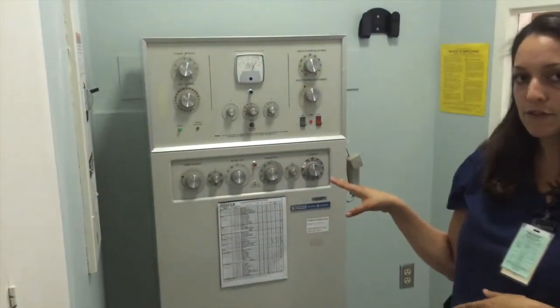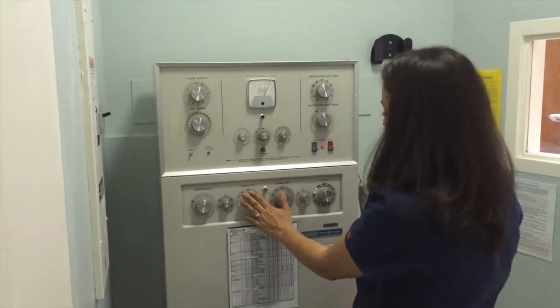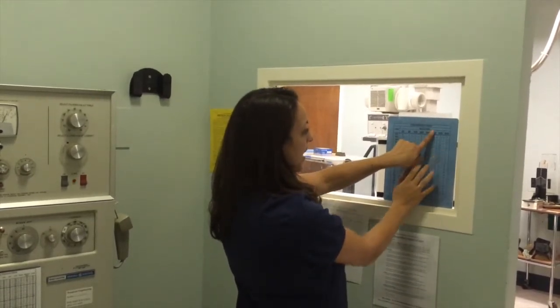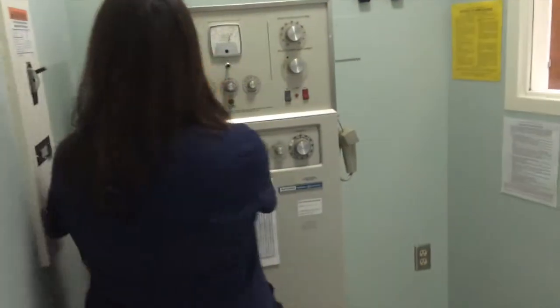Okay. So also, I'm going to set the technique. For the knees, they vary, but they're about 65 to 70 kV, and it could be anywhere from 3 to 6 mAs depending on what view we are doing and the patient size. Since we are in the bucky for the first view, I'm going to set it up for a 70 kV, which is right here, major kV. And then over here, I'm going to choose a 4 mAs, only because it's a little on the hotter side due to the fact that we are in the bucky. So I find 4, I get 400 mA, and I come over here and I get 0.01 time. So this is at 400 mA, and 0.01. And now I'm ready to go get my patient.